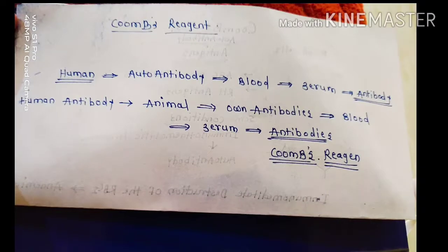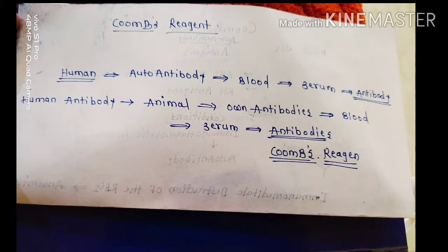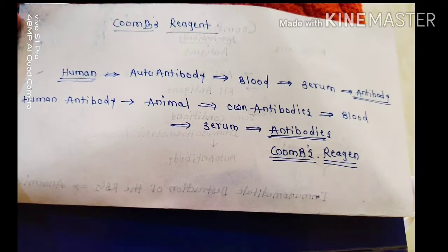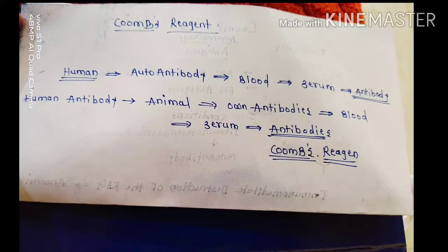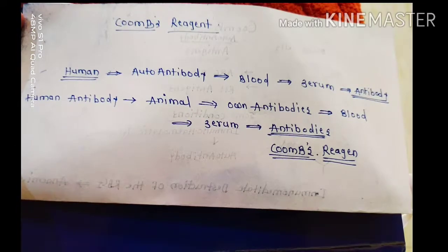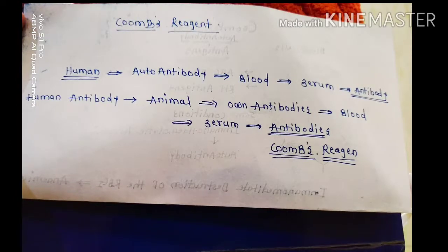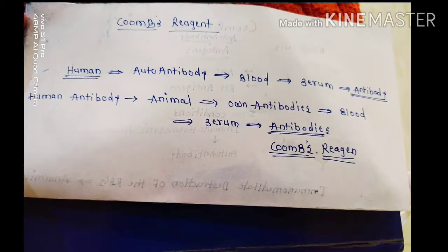Next, we will discuss the two types of Coombs test: direct and indirect. Before discussing these types, first we need to know about the Coombs reagents. Let's discuss the Coombs reagents.